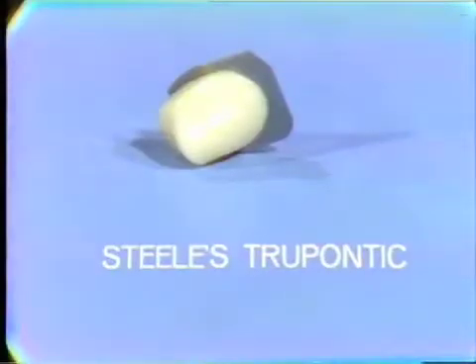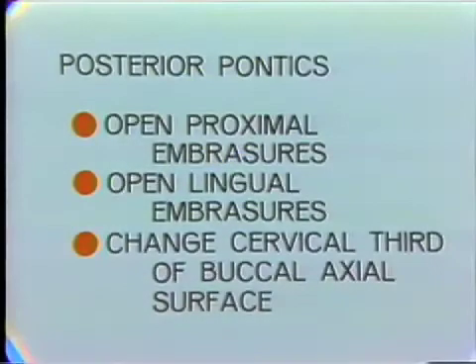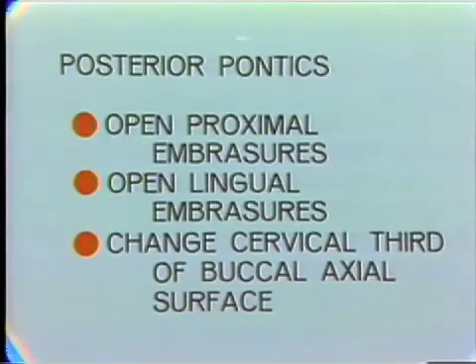Steps in the adaptation of a Steele's Trupontic for a bridge replacing the left first maxillary bicuspid tooth on a test bridge. Before we go through the technical stages of adapting the Trupontic, let's take a quick look at the key points in developing a posterior pontic.